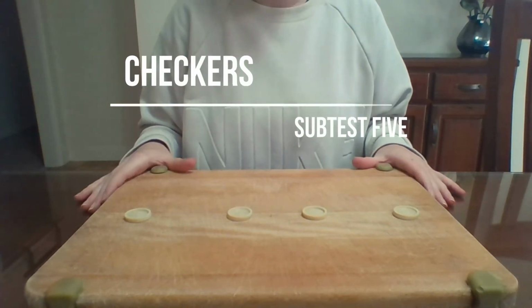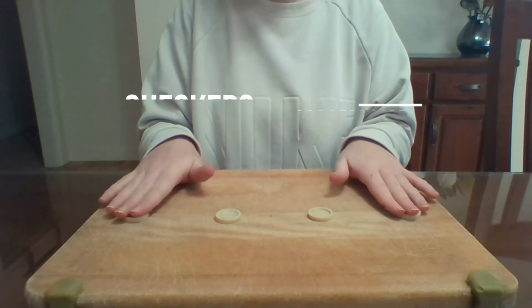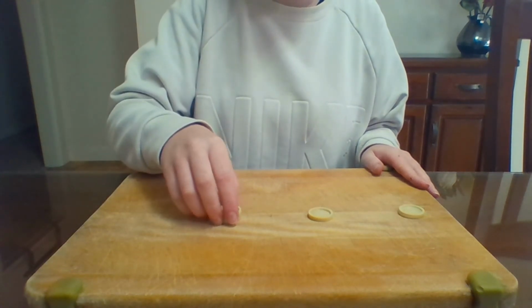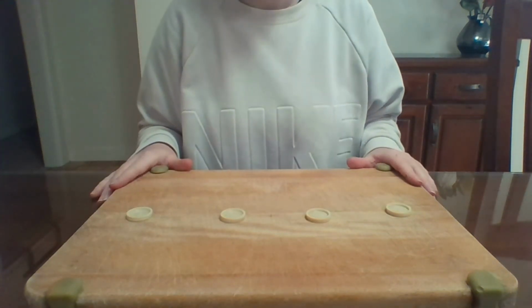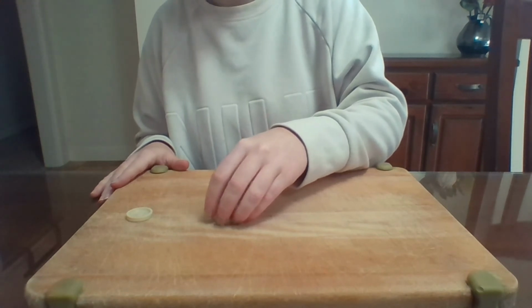Place 4 checkers in a row on the board which is clamped to the desk, 2 on each side of the centre of the board. Once instructed to start, the participant will stack the checkers on top of each other one at a time. The participant completes this task as fast as they can, beginning with the non-dominant hand whilst the assessor is timing. Then complete this test on the dominant hand and set up in the same way.